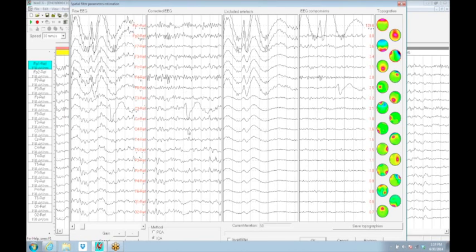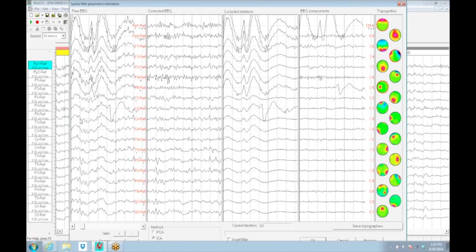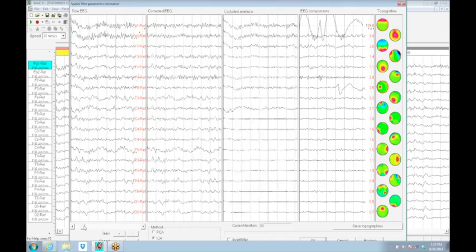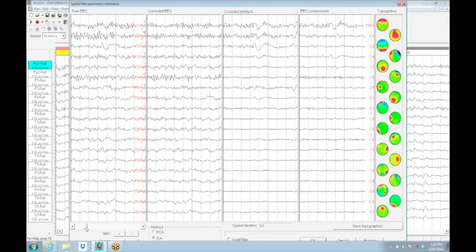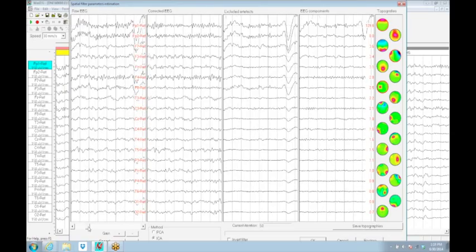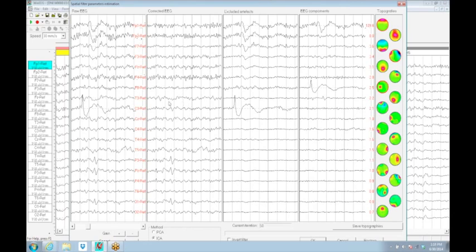However, everybody can probably recognize this little culprit here at C3, the C3 electrode pop. That electrode pop is a discrete focal C3 component. You can see here it is. If we select it, it takes out that C3 component, leaving quite a bit of the C3 activity. It's essentially the same as C4 here, without really damaging it too badly. But it takes out a component that's a frequent, isolated C3 blip. You can see how often it cruises through the display here as you scroll left to right. This is being pulled out as that component.